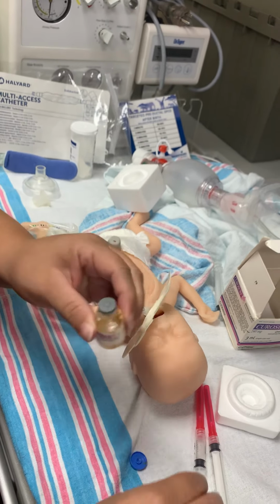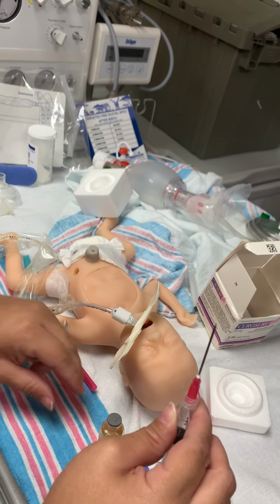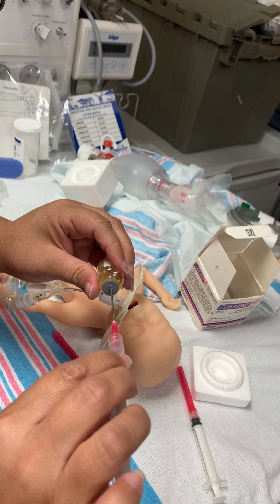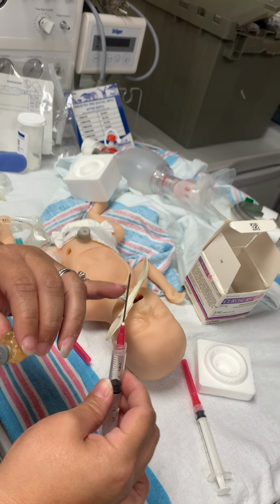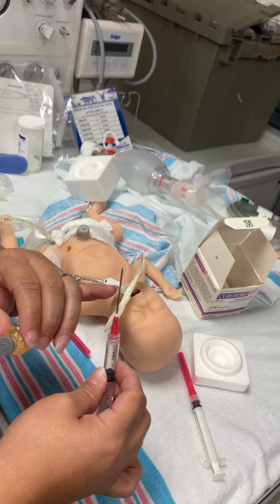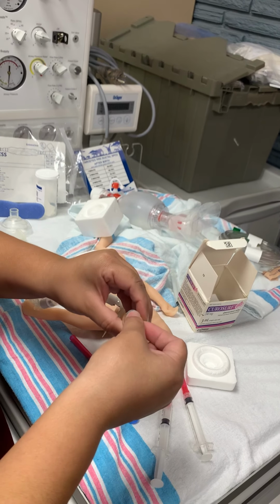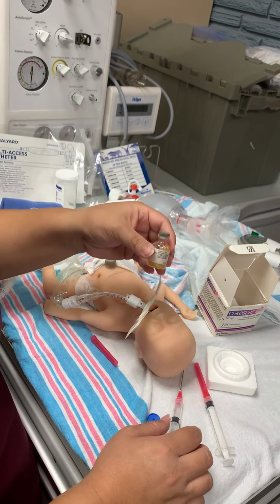The reason for that is this large bore needle has a pretty big orifice there. So what can happen, has not happened here or anywhere that I specifically know, but what can happen is that large bore, as we pierce the rubber, a piece of the rubber can end up inside of the needle, and you could potentially be giving a piece of rubber in with the surfactant. So that's the main reason why we remove the entire stopper and aspirate the entire contents that are in here.